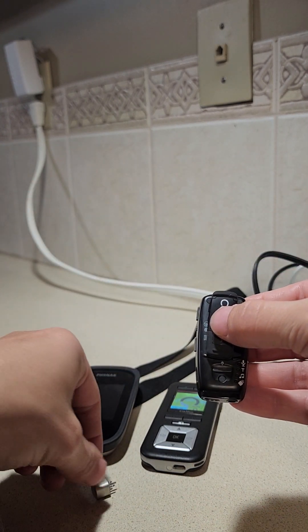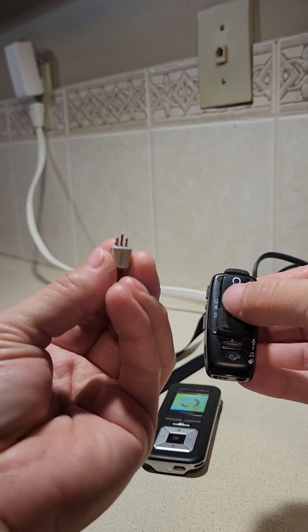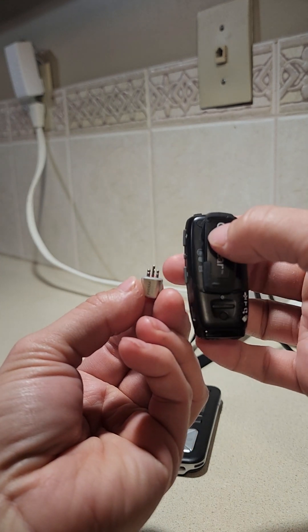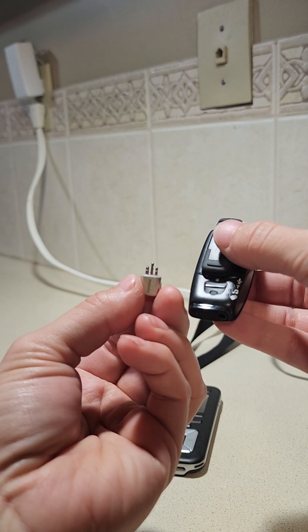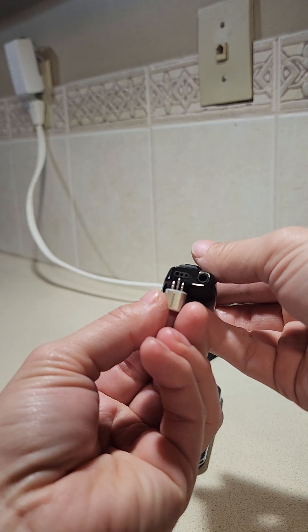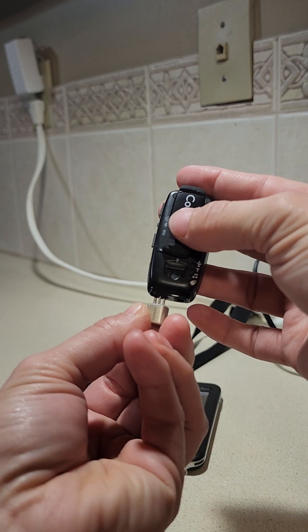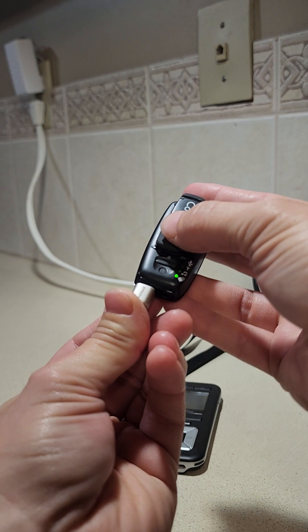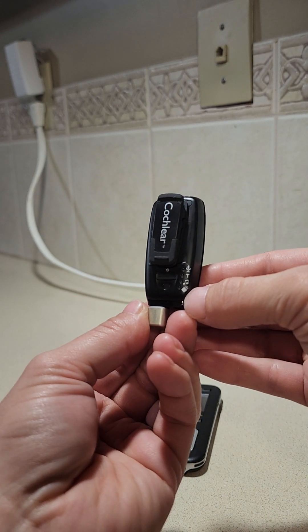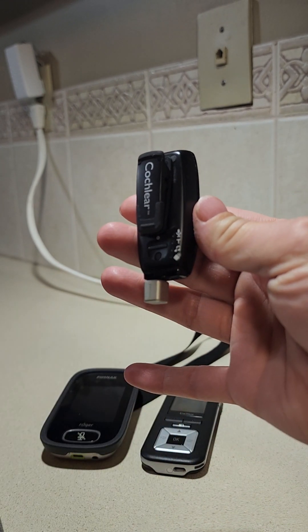Once all the devices are turned on, you'll need to take the Roger X, which is this little button. It has one post that's a little bit thicker than the other two, and that is going to get lined up with the hole that's a little bit thicker than the other two in the end of the Mini Mic. Those get plugged in, and as soon as it plugs in it should turn green on the DM system option.